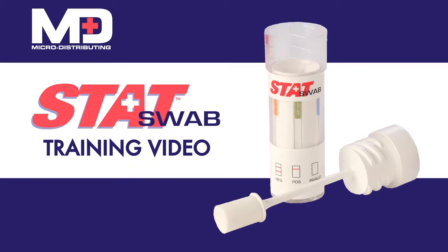StatSwab is a new and innovative, fully integrated, on-site oral fluid drug and alcohol testing device. The StatSwab is easy to use and provides fast and accurate results.